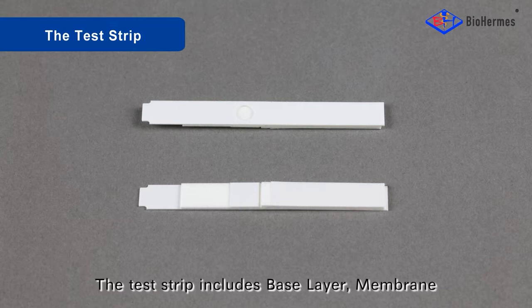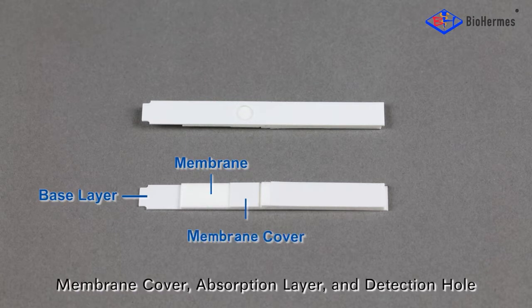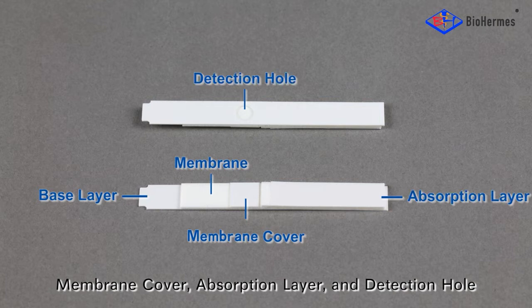The test strip includes a base layer, membrane, membrane cover, absorption layer, and detection hole.